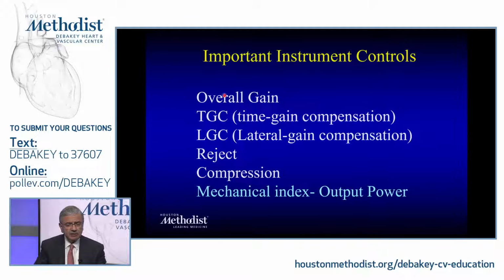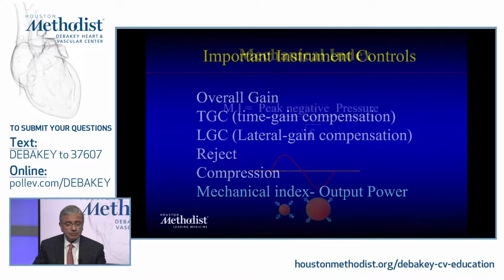All these are post-processing, meaning this is the ultrasound beam that has come back to the transducer, has excited the piezoelectric crystals, and we're trying to understand that. But all these are post-processing. The only one that really changes the energy or the output power is the mechanical index. That's the only one that increases the energy that is sent from the transducer for these reflected ultrasound waves to come back to your transducer per se.